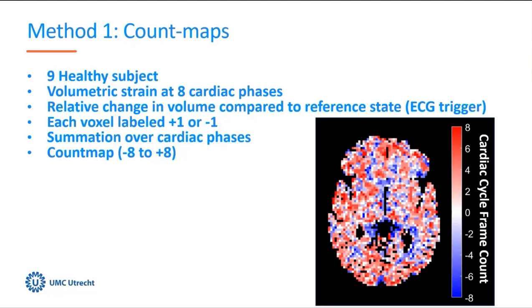Going on in the brain, but more often compressed than expanded. So to quantify this a bit more, I looked at the size of the positive ROI and the negative ROI, where the positive ROI is the expanding ROI with all the voxels being larger than 0, and the negative ROI is the compressive area with all the voxels being smaller than 0.